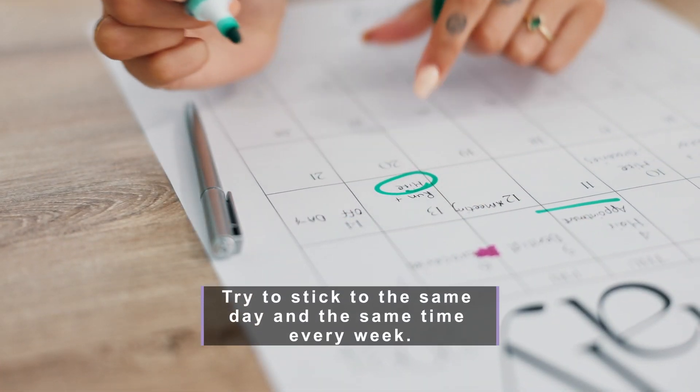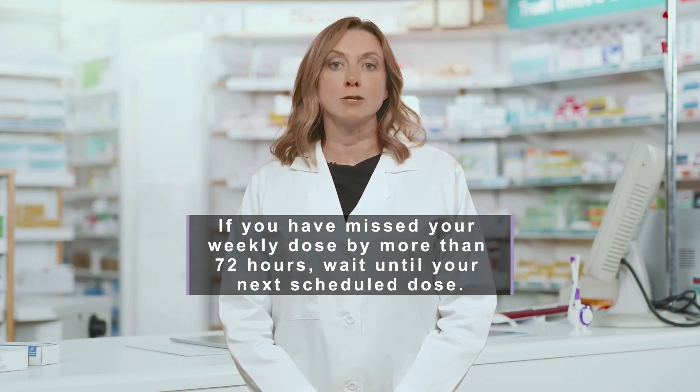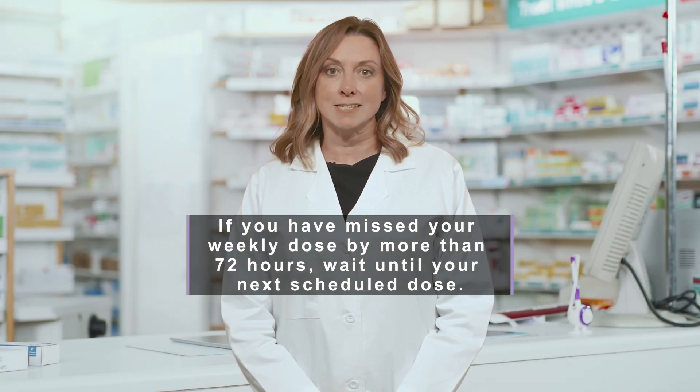Usually the dose is only once a week. Try to stick to the same day and the same time every week. If you have missed your weekly dose by more than 72 hours, wait until your next scheduled dose.